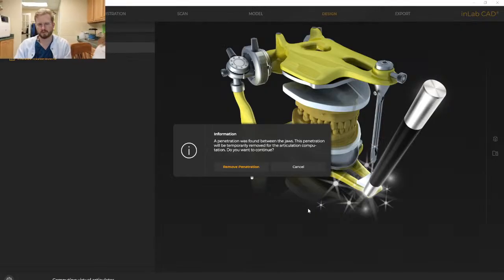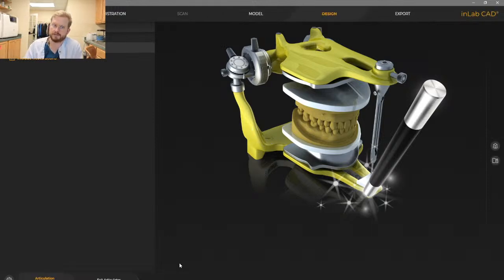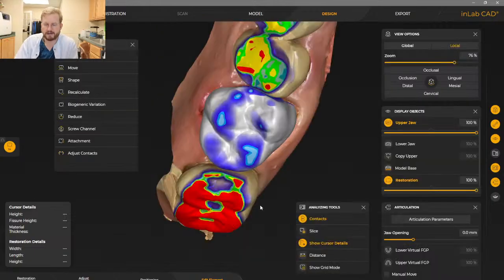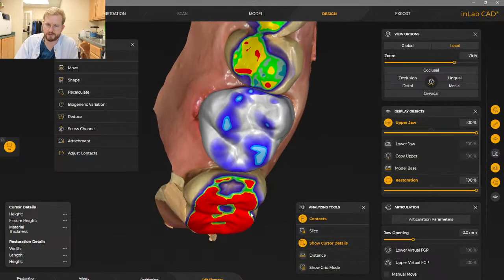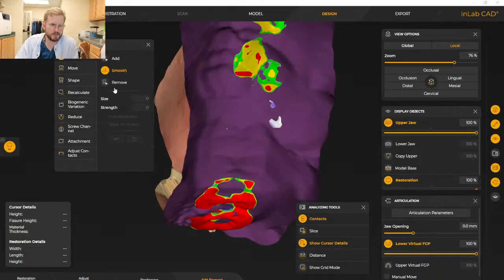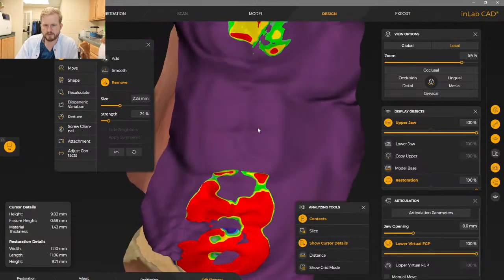You're good. All right, articulator's going. That's the night guard that we designed this morning. If you look at the live stream right before this, you'll see that design. We printed it, and my assistant Jody is removing these supports. I think we turn night guards around in like a couple hours. It's pretty quick. But FGP, functionally generated path. When her jaw moves around, she's got some interferences in the places that come through the purple shield or the purple guide. So we're just going to form remove those.